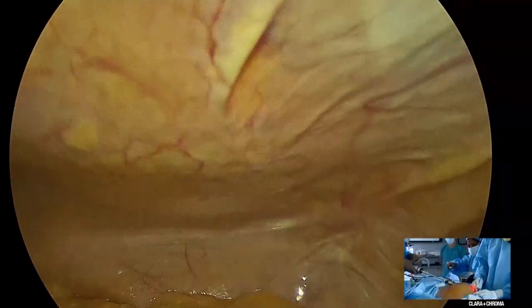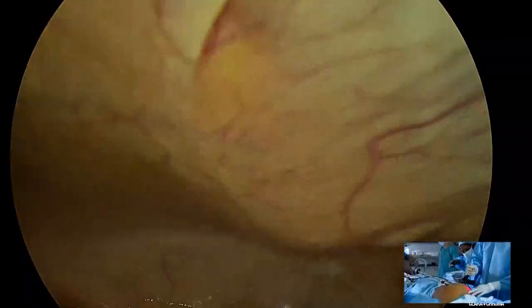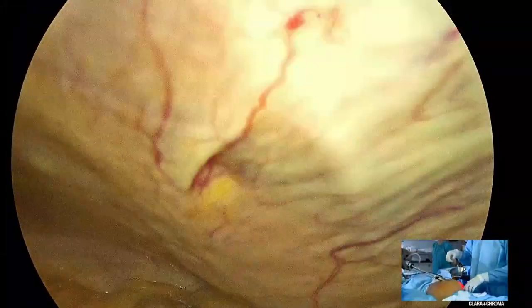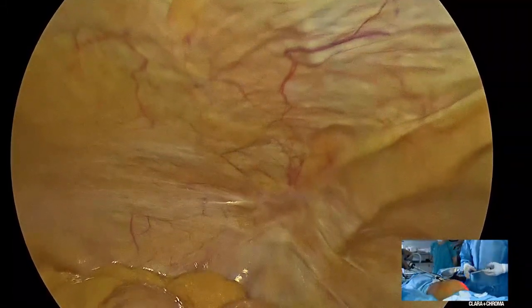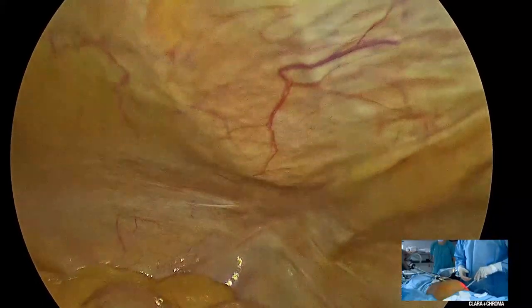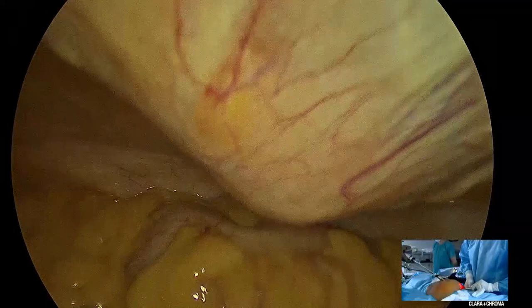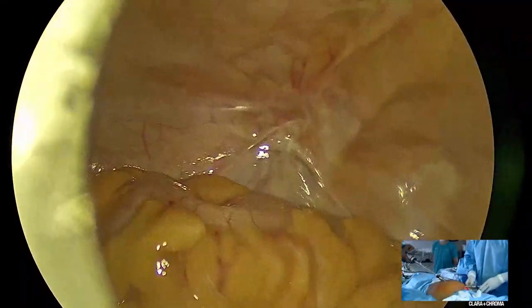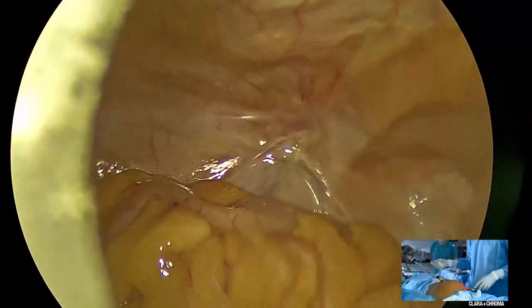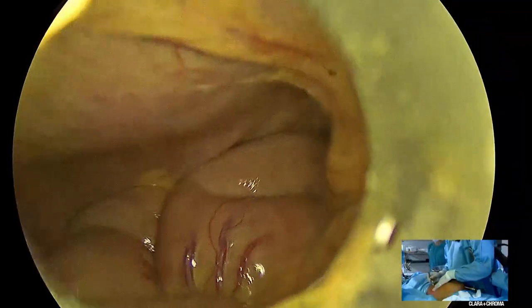Where exactly is it? Is it midline, midclavicular line, midinguinal point? It's in the left lower quadrant. So away from the midline. Normally I would go for a 5, but today I'm going for a 10 here because of the fact that we have to. We need to alter our game plan a bit because of these adhesions. So that's that.